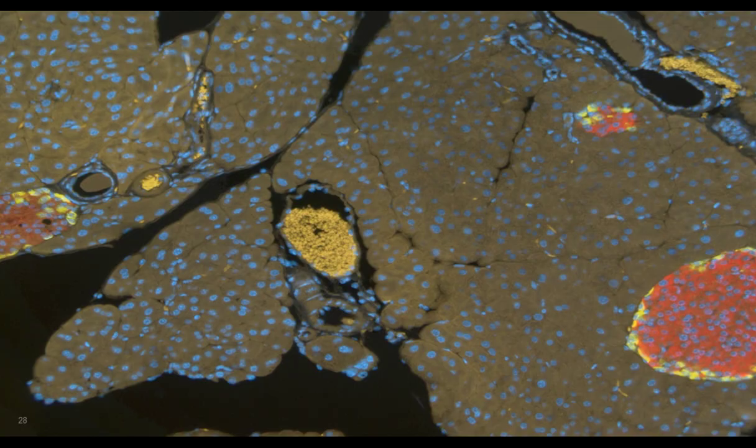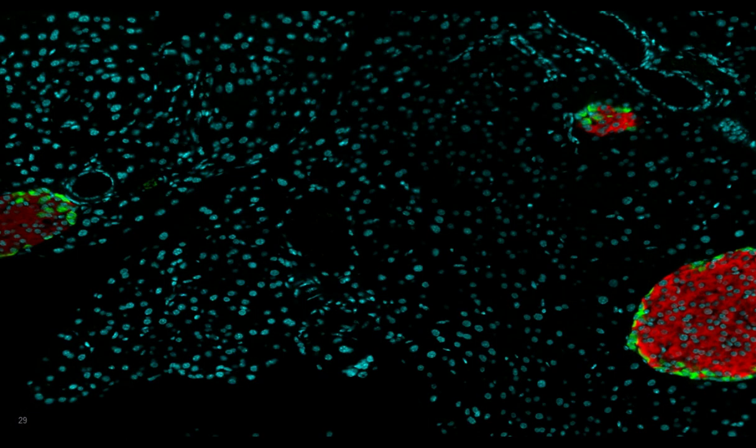And to give you an example of that, this image shows pancreas mixed and with autofluorescence. If we unmix, we isolate and remove the autofluorescence, giving us this image. So you can see this is very powerful and will help you have confidence in your data.